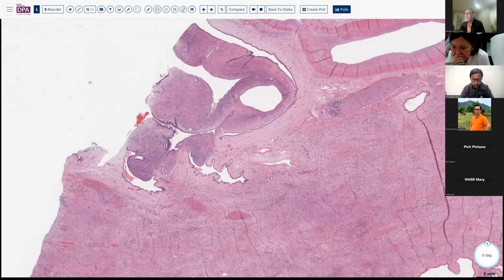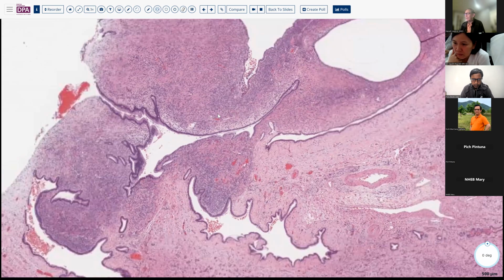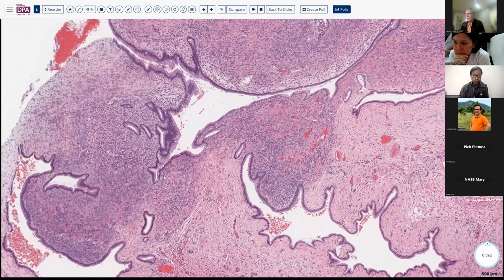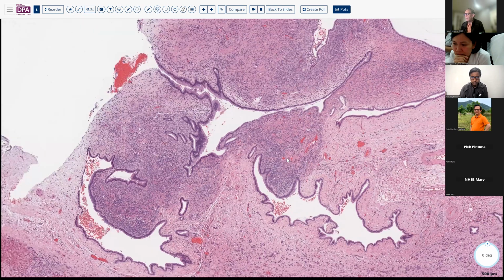Here we see this mucinous epithelium and this distinctive stroma, quite cellular, and looking a lot like ovarian type tissue. We do have a few goblet cells in the mucinous component. So it may have a mixture of both enteric types and so forth.